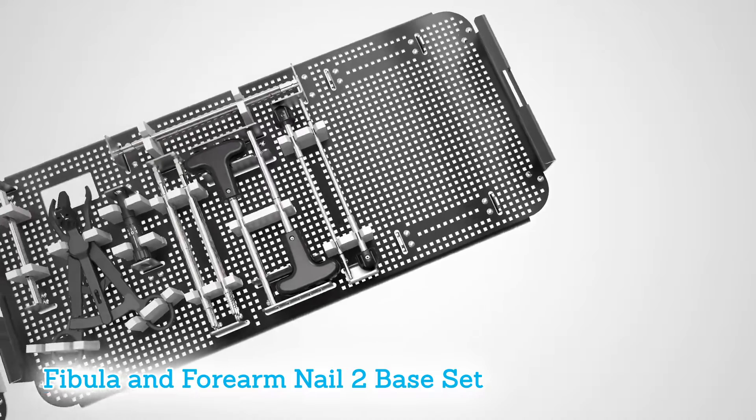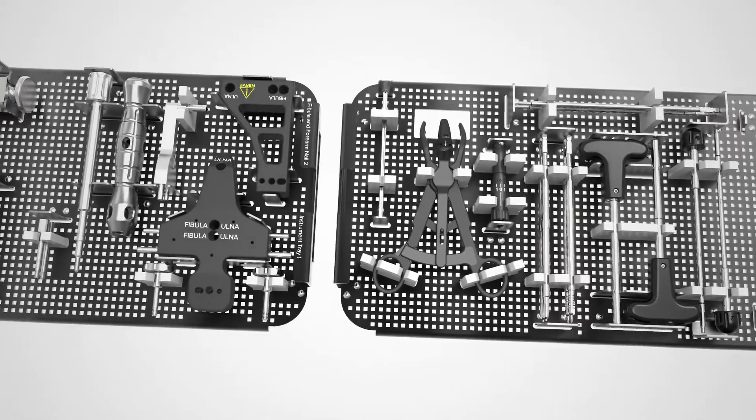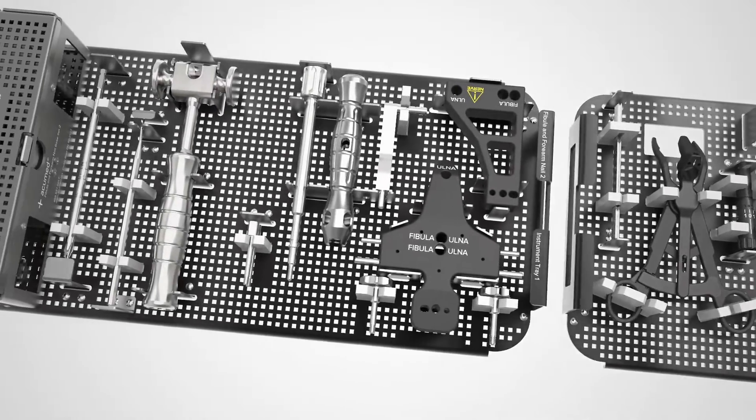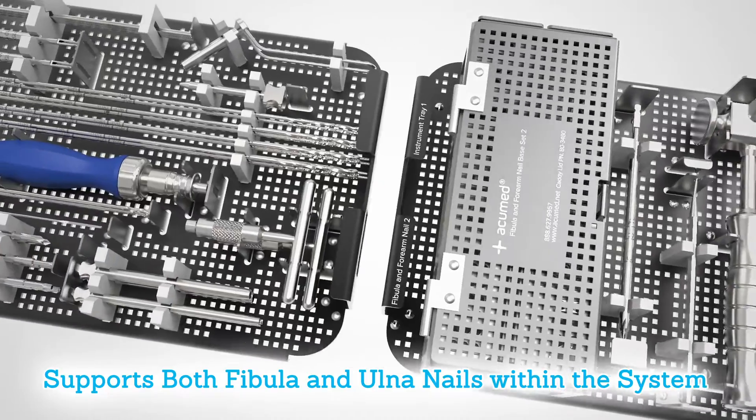The fibula and forearm nail 2 base set is designed as a universal instrument set that supports implantation and removal of both fibula and ulna nails within the system, streamlining complementary surgical procedures.